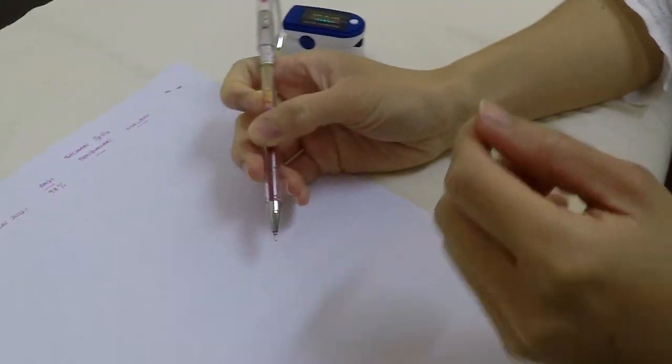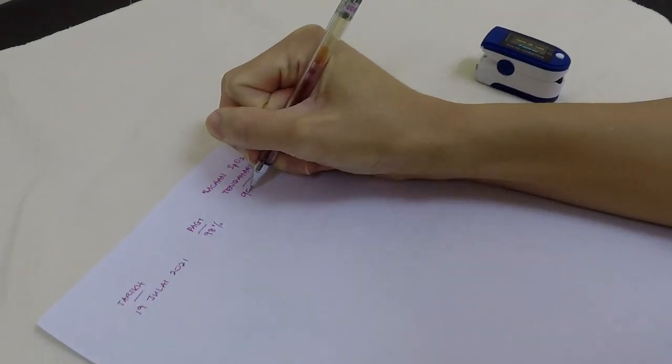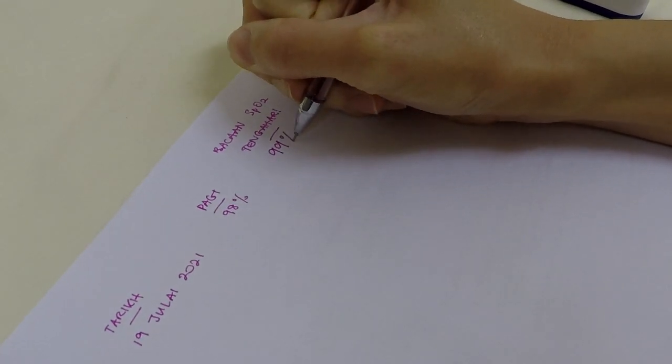Measure your oxygen saturation 3 times a day, morning, afternoon, and night. Take extra measurements if you feel unwell.